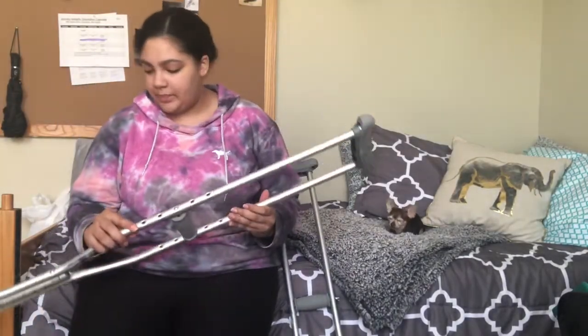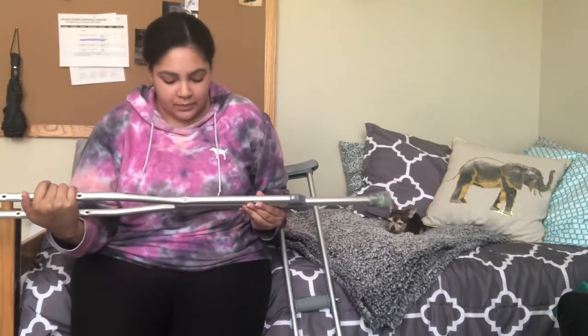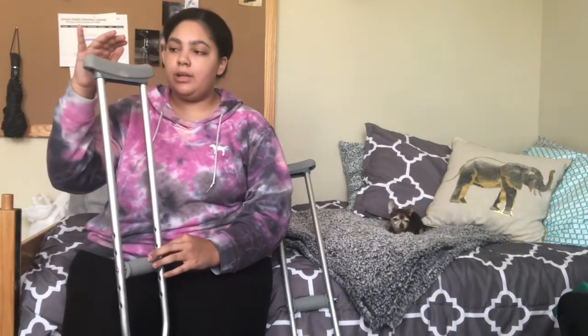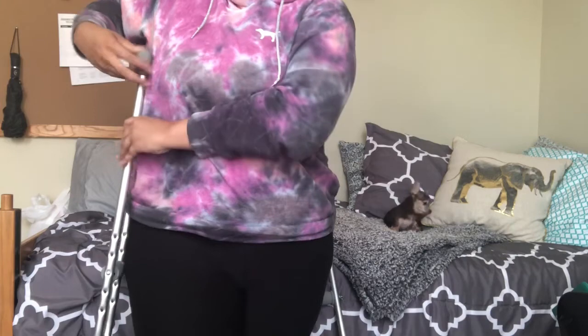With your crutches, it comes with a measurement for your height. I'm around 5'8" so it's an approximate height setting. When setting up your crutches, you want this piece under your arm to be 2 inches away from your armpit, and then from here you want to be able to place your hand — that's where it needs to be.